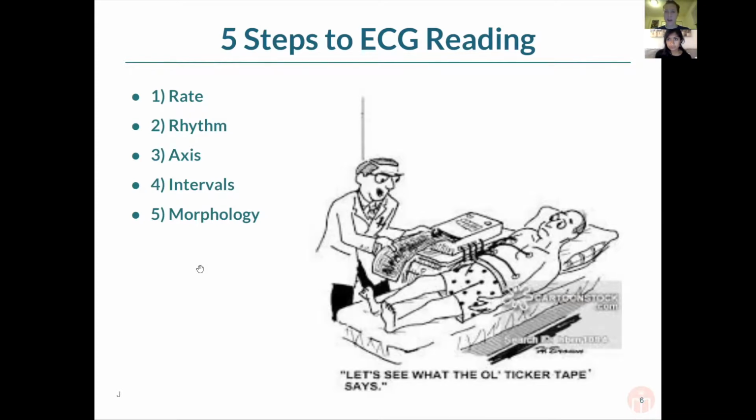And the second step would be to ask yourself about the rhythm. And obviously, probably the biggest question overall is, is it sinus rhythm or not? And we're going to talk a little bit more about what that means as well, but there's a variety of different rhythms, and that's something that you will always want to ask yourself when you're interpreting these EKGs.